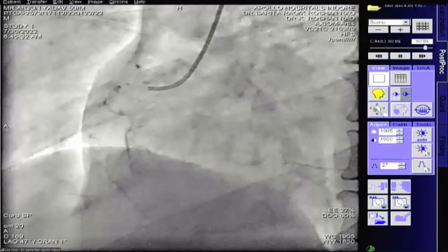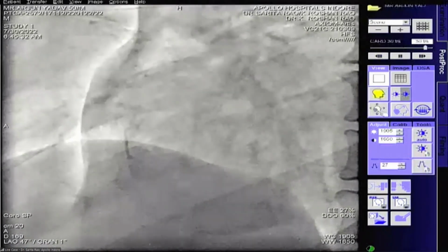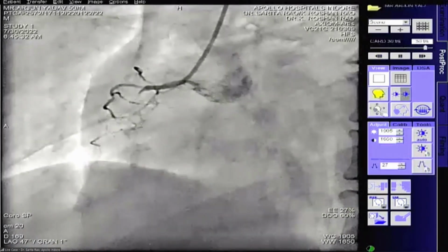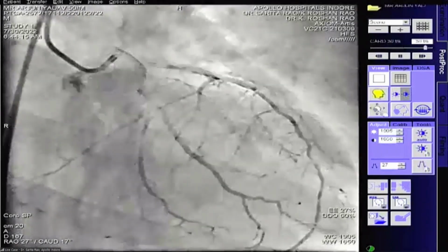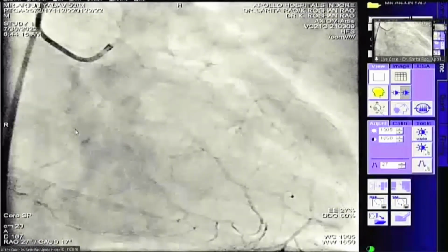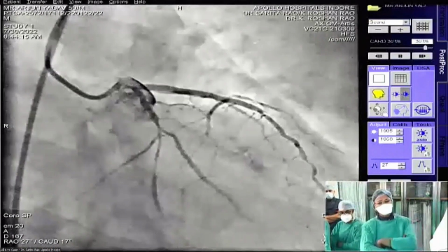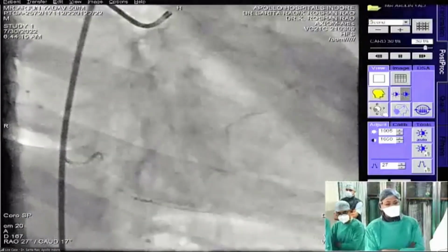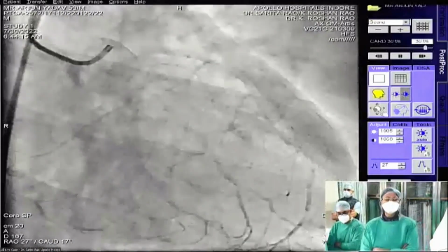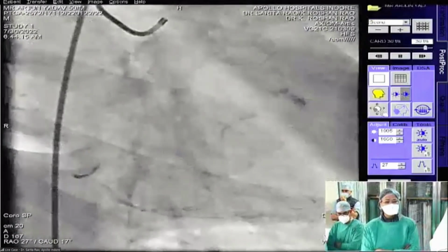Thank you. I think that's a great segue. Dr. Sandeep Bansal is here. What do you think? We generally would do the tougher lesion first. So one would approach the right coronary first. This is a surgical reject, but by and large, if we are approaching a patient who has not been decided or has been taken up for PCI itself, we would first approach the right coronary artery, and if you can't do that, then send the patient for CABG. But here, since it has already been refused, I think even approaching the left system may be a good option.